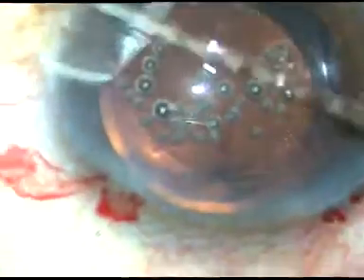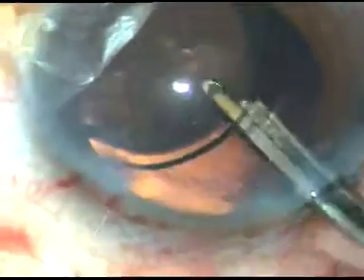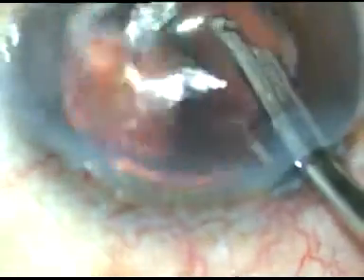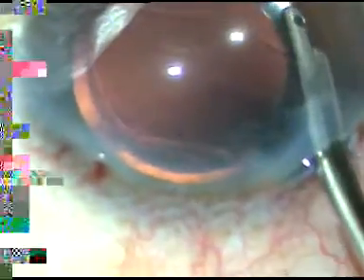The viscoelastic substance has to be removed. What I am doing is irrigating some BSS into the anterior chamber, going behind the IOL, and irrigating some BSS into the capsular bag. By irrigation only, a lot of viscoelastic comes out. After removing some viscoelastic, I use bimanual IA to remove the viscoelastic further.